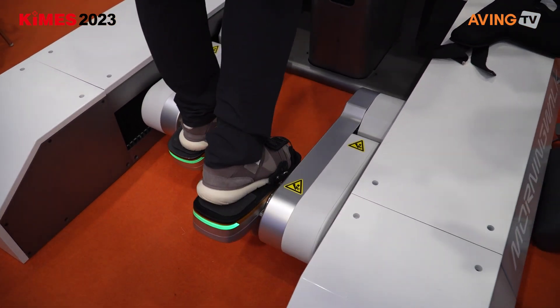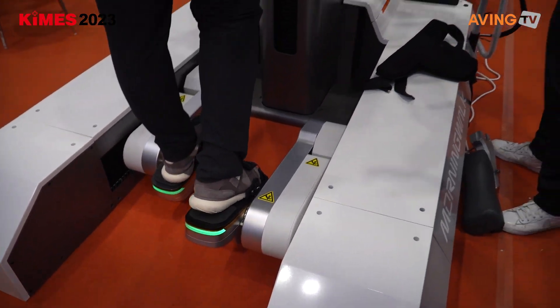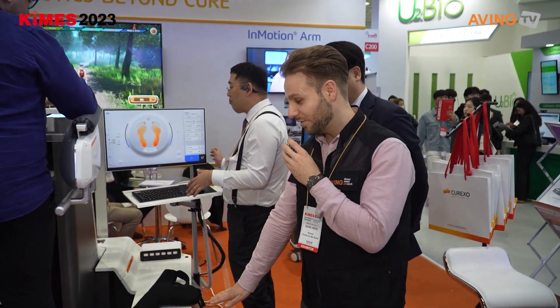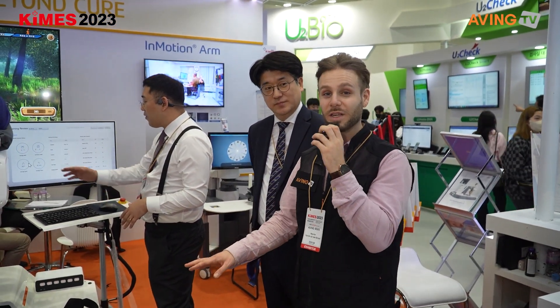For example, you can imagine walking up the stairs, and when you come all the way up there's no stair anymore — it's a flat surface suddenly. So you can mimic the same thing. As you can see right now, it's a flat surface. So it mimics exactly everything in real life.